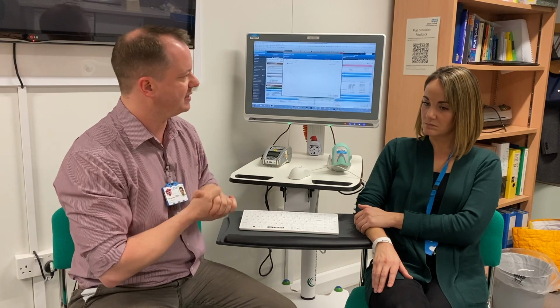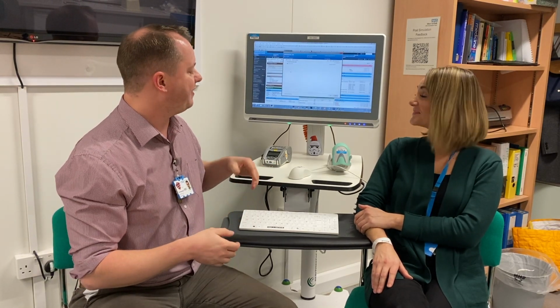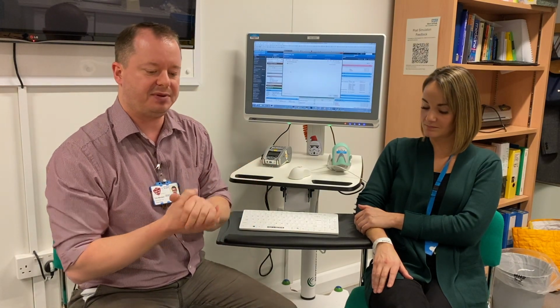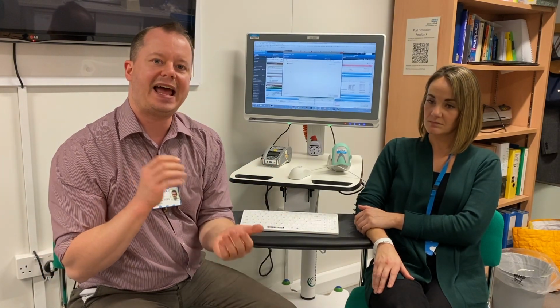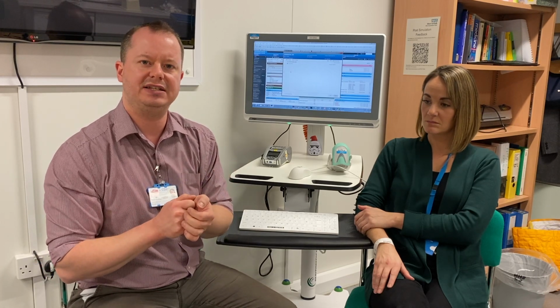We've got it in bottles, we say thank you very much once we're all successful, after we're really well trained. And then once we've finished, we need to label the blood sample, and we need to stand at the patient's bedside to label the sample. We can't walk away with an unlabeled sample because there's a chance that we might pick up a wrong bit of paper, we might put the wrong details on it.